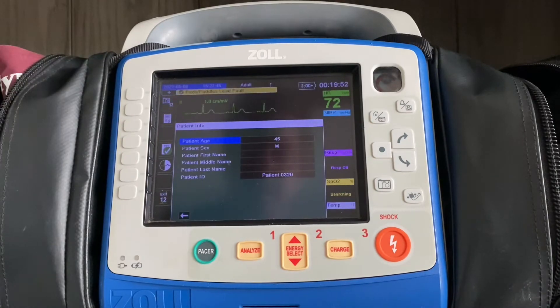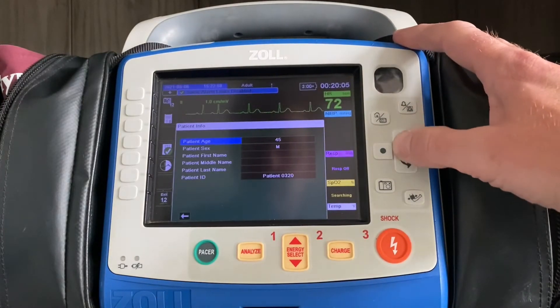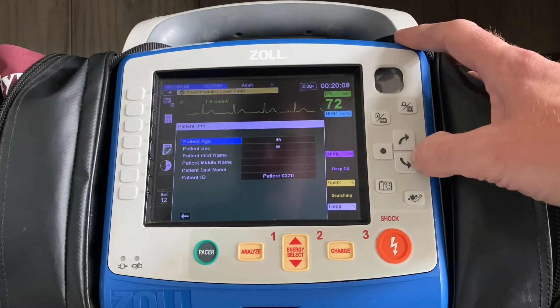The machine will prompt you to put in the age and gender of the patient, which defaults to a 45-year-old male. If it's a male patient, you don't need to worry about the gender at all — you just want to adjust the age, assuming they're not 45. You do that by using the arrow keys and the enter or select button on the right-hand side.